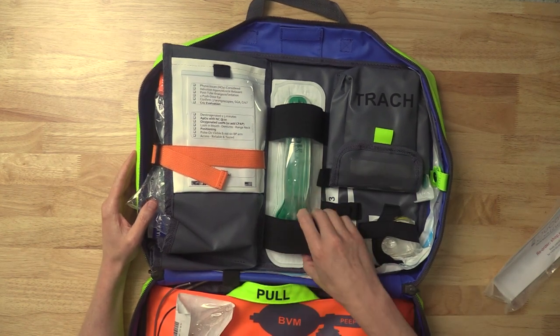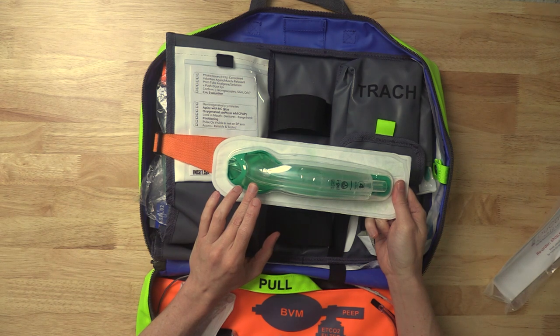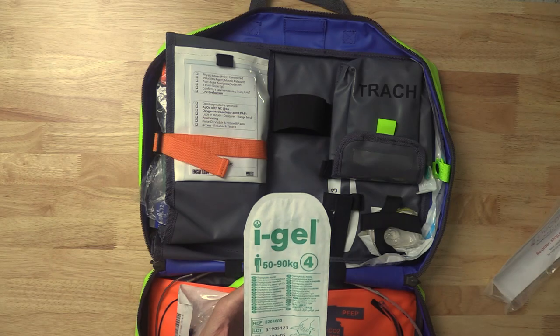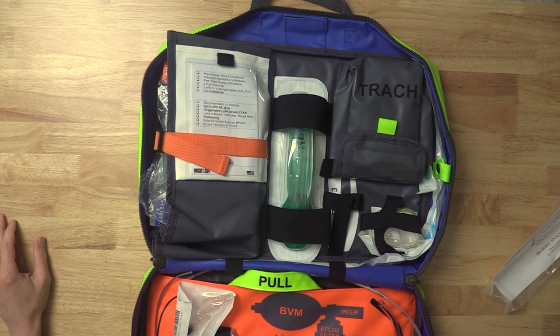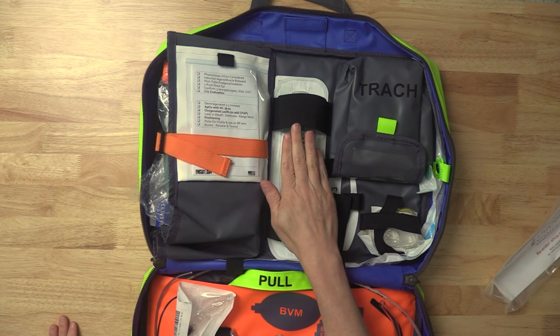Up here we have the supraglottic airway. This one is my preference — the iGel 4. No cuff to inflate. It rewards ham-handed placement; the way you screw this device up is you don't push hard enough. Some supraglottic airways fail if you push too hard — this one fails if you push too soft. When you have a patient with a sat of 50% that you're rescuing, you will be 'ape hands,' so the one that fails by not pushing hard enough is the one you want. If it's not sealing, oftentimes the problem is you just have to lift the jaw and push a little harder. The range on this is 50 to 90 kilos — ideal body weight — which means only very tiny or very tall people will need a different size. This covers the entire gamut of almost every patient you see in the emergency department.